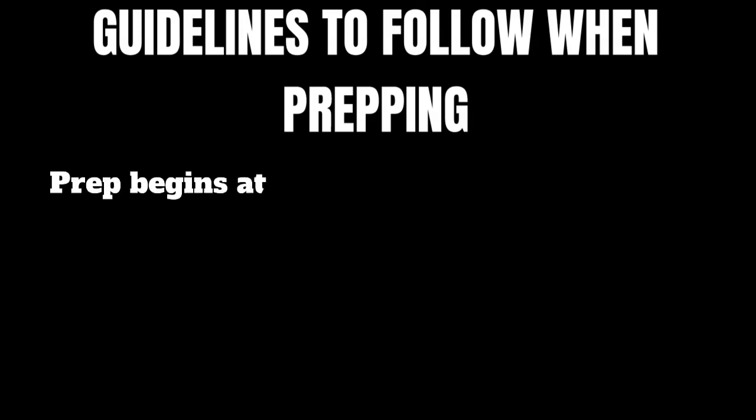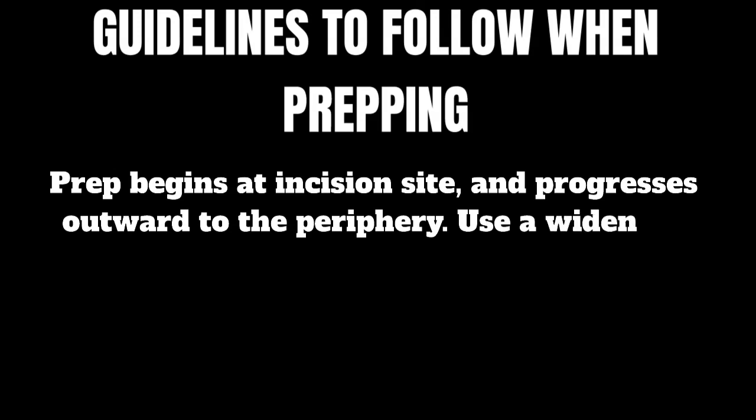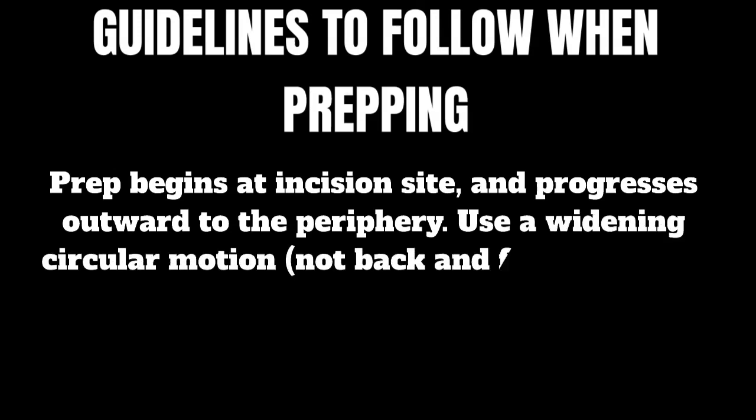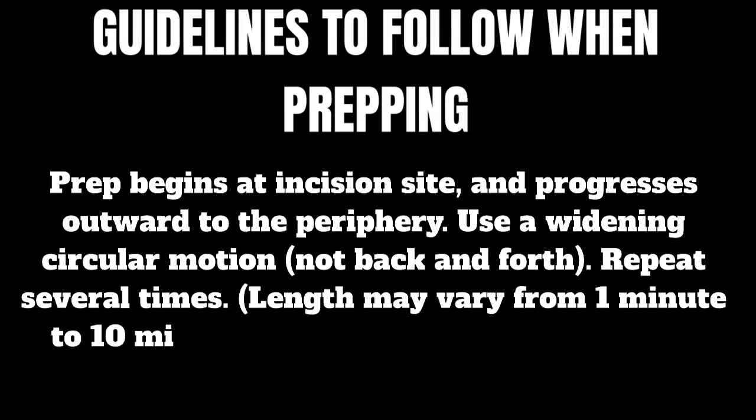Prep begins at the incision site and progresses outward to the periphery. Use a widening circular motion, not back and forth. Repeat several times. Length may vary from 1 minute to 10 minutes, depending on the prep.